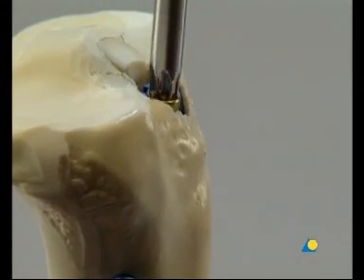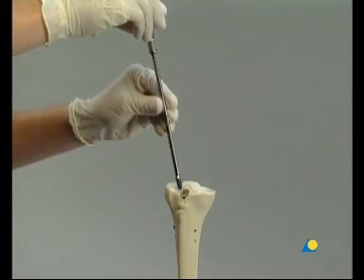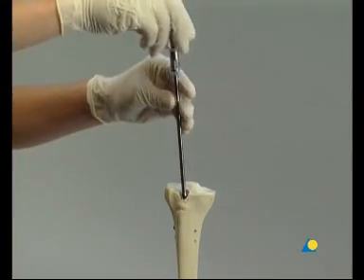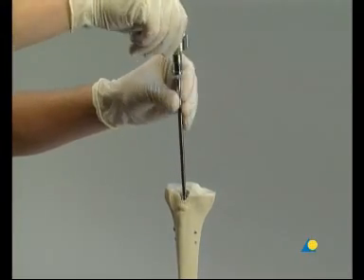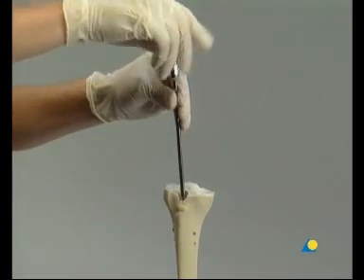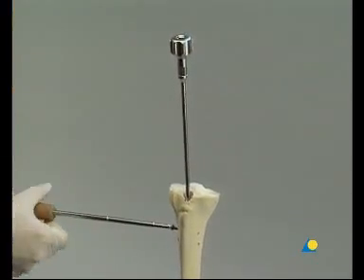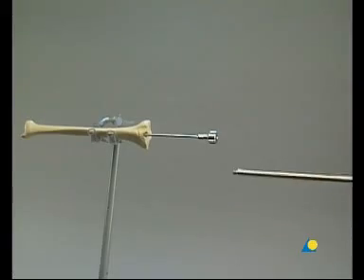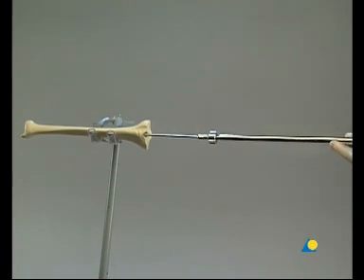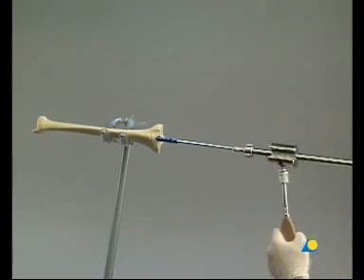Implant removal begins with the end cap, using the star drive screwdriver. The extraction screw is introduced into the nail and tightened. The proximal locking screw is used to prevent rotation or displacement of the nail posteriorly below the tibial plateau. All locking screws are removed with the star drive screwdriver and holding sleeve. The hammer guide is attached to the extraction screw, and the nail is removed with gentle hammer blows.